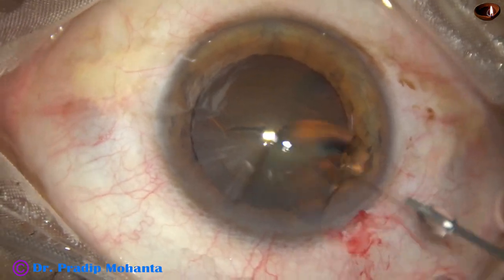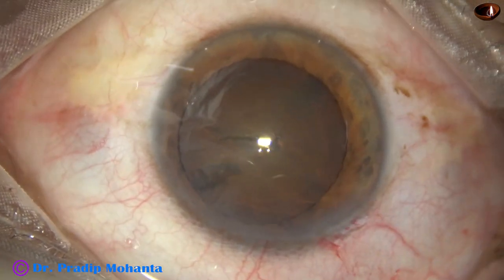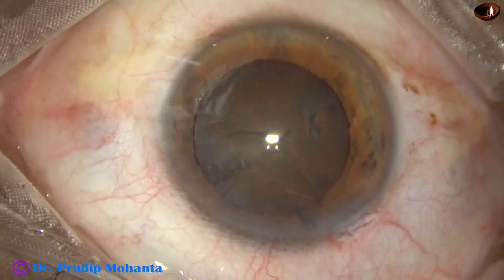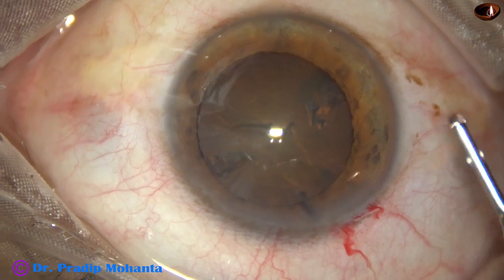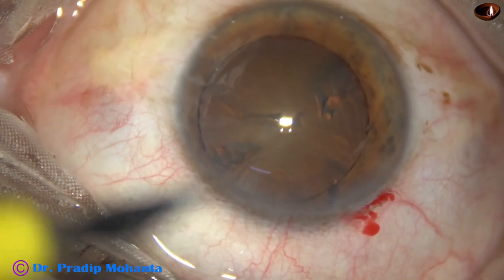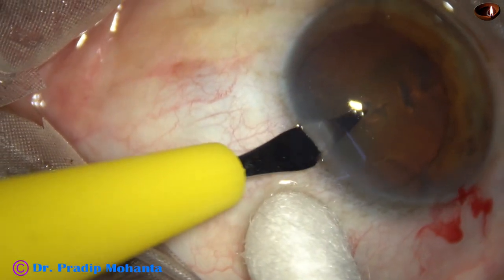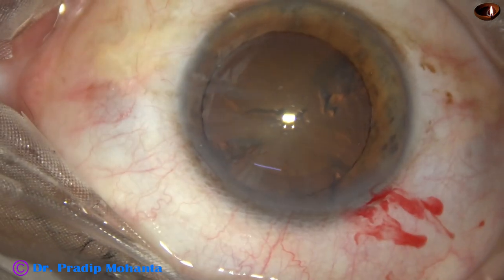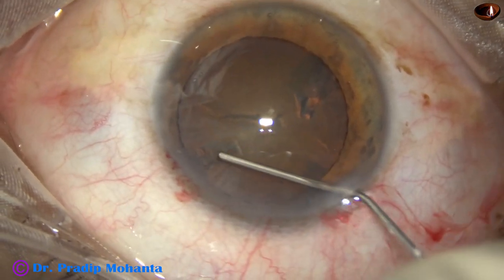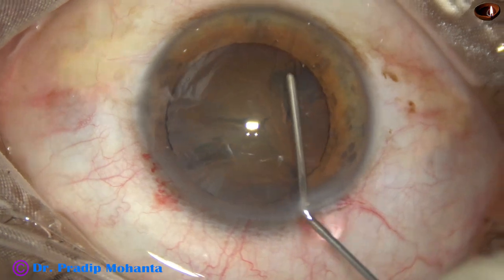Hydrodissection was very much tricky. I could not pass a fluid wave from one side to the other side. This is the second attempt — no fluid wave. The side port had not been made, so a side port is created on the left side of the main incision, about 3 o'clock hours away. Third attempt of hydrodissection — no fluid wave passes from one side to the other side.